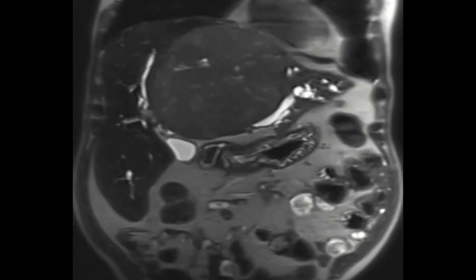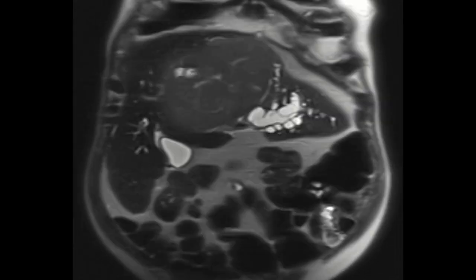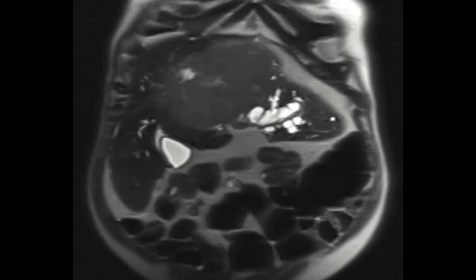When hyperbilirubinemia is the primary reason for biliary decompression, it is important to assess the volume of upstream liver parenchyma that will be recruited via EUS-HGS. Patients with liver atrophy will not achieve significant improvement in serum bilirubin. This is, however, a moot consideration when cholangitis is the primary reason for drainage.